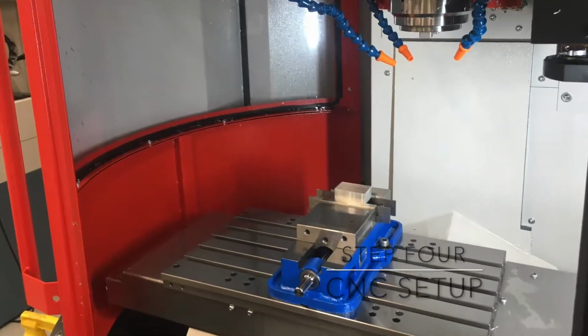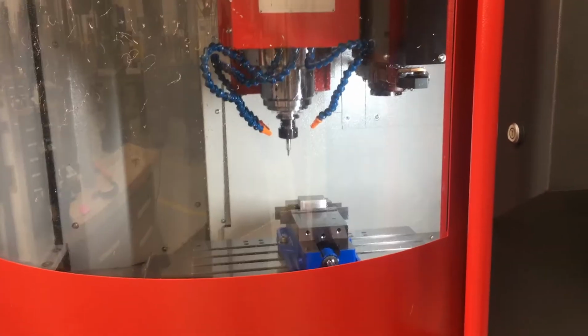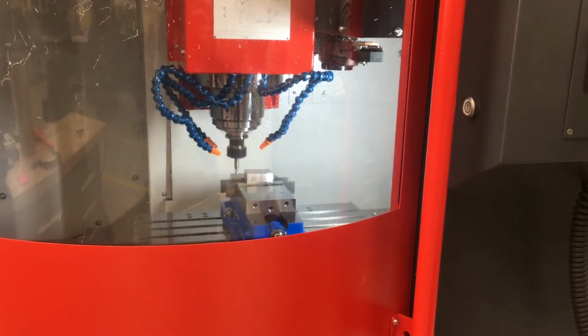Use parallels to install your workpiece properly into the clamp. Install any needed tools into the machine and calibrate them. Also, conduct a 4-point square calibration on the workpiece so that the CNC can determine where the center of the workpiece is.